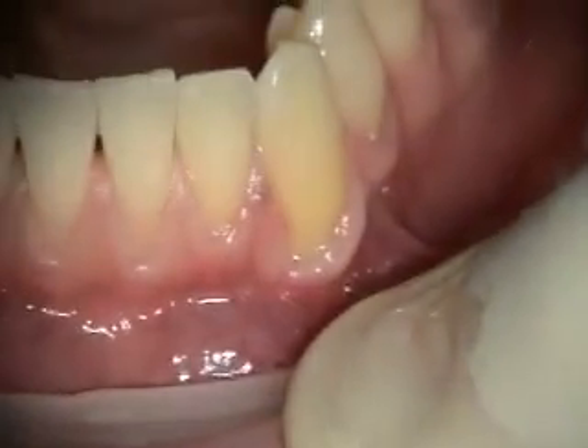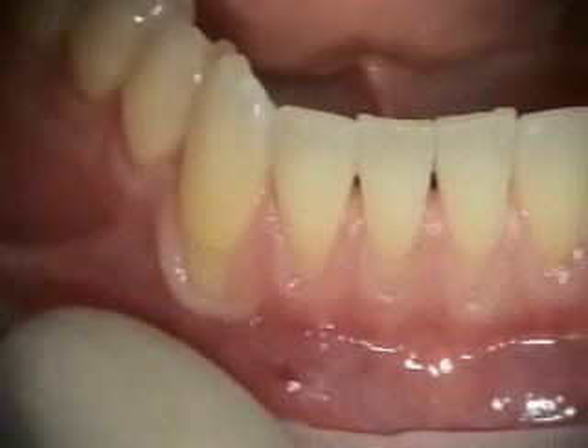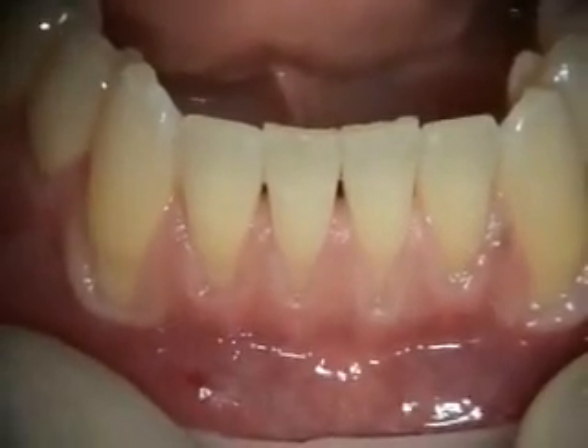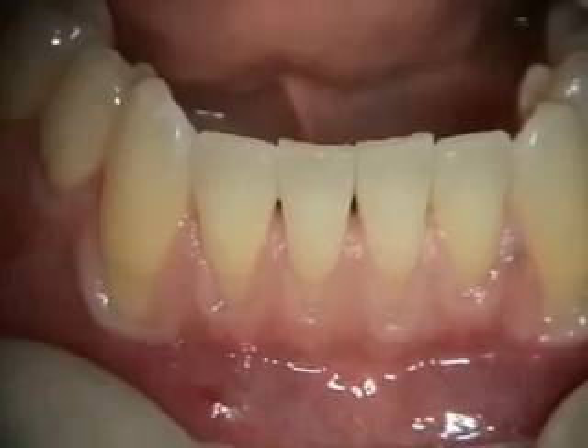Today we're doing some alloderm grafting from number 22 to 27. You can see he's got very thin tissue there and lots of recession on the cuspids, so we're going to be doing coronal positioning and alloderm grafting.